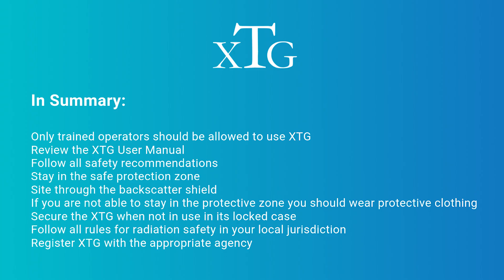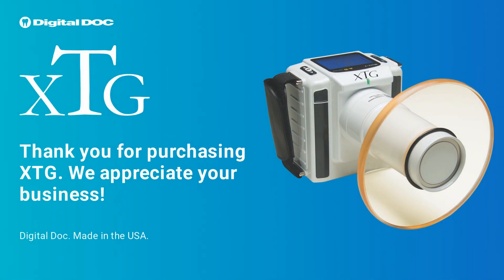In summary, only trained operators should be allowed to use XTG. Review the XTG user manual and follow all safety recommendations. Stay in the safe protection zone and sight through the backscatter shield. If you are not able to stay in the protective zone, you should wear protective clothing. Secure the XTG when not in use in its locked case. Follow all rules for radiation safety in your local jurisdiction, and register the XTG with the appropriate agency. Thank you for purchasing XTG — we appreciate your business.